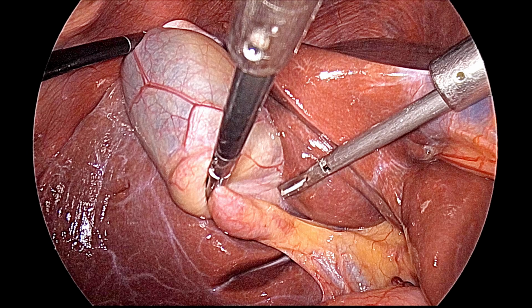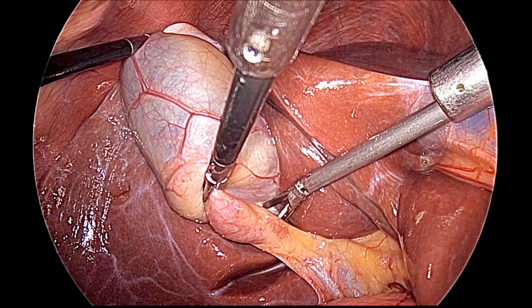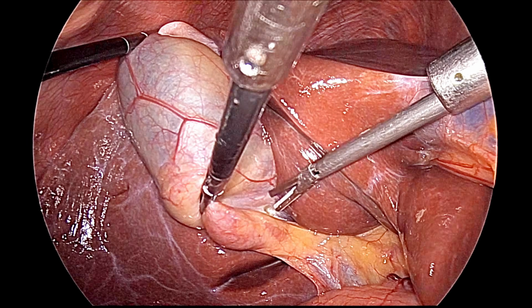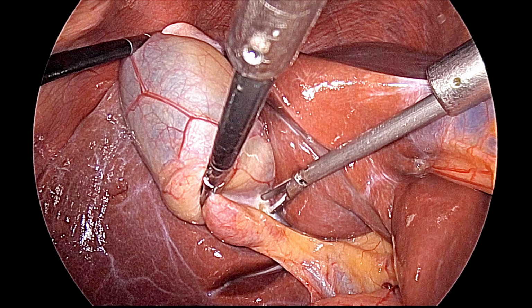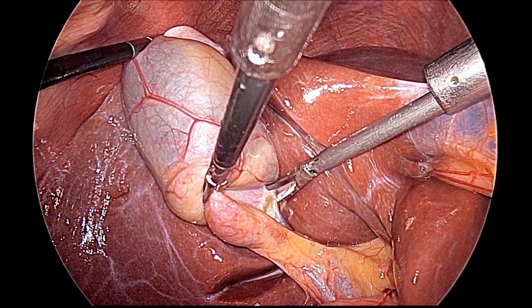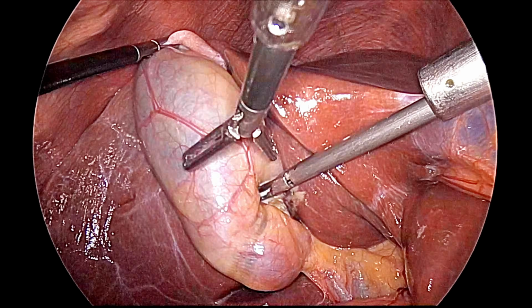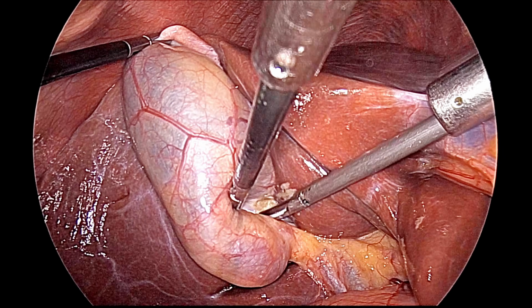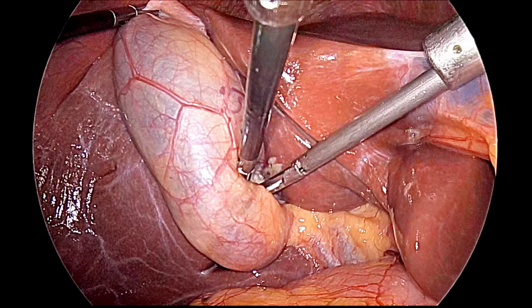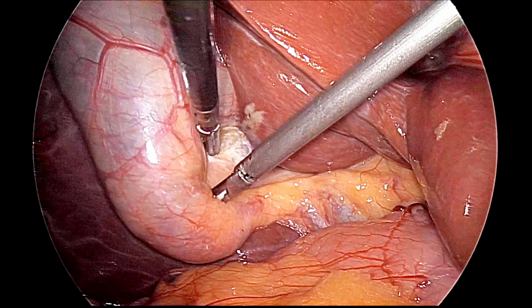After that, we will give anteromedial traction, and at the same level, the anterior peritoneum should be separated. And at that time, the left hand must give anterolateral traction. And we should try to remain as near as possible to the liver. However, direct touch of the liver should be avoided. And we can see this way, if you separate, the cystic plate will open and you will get a posterior window.